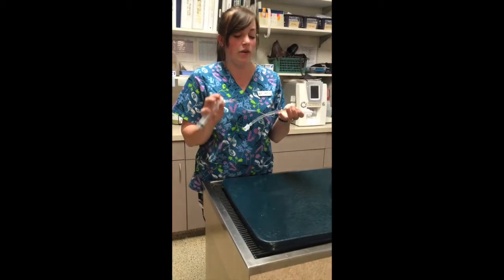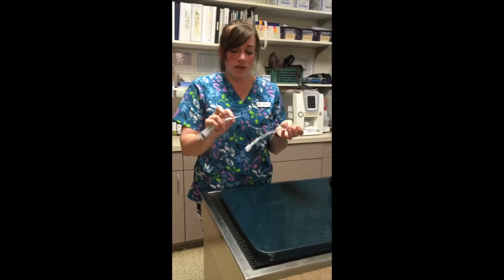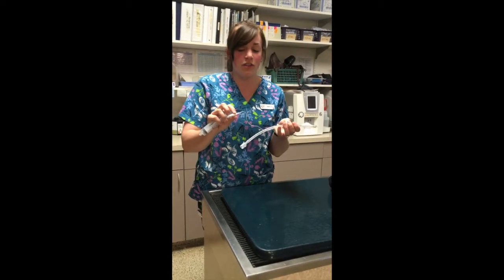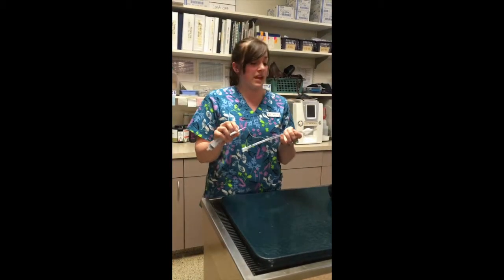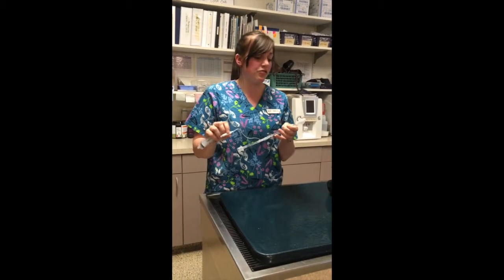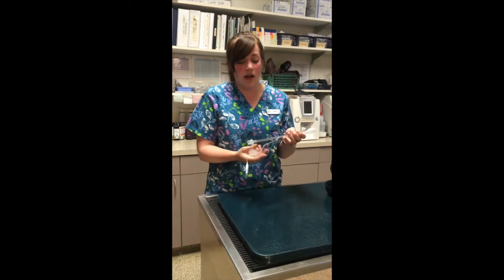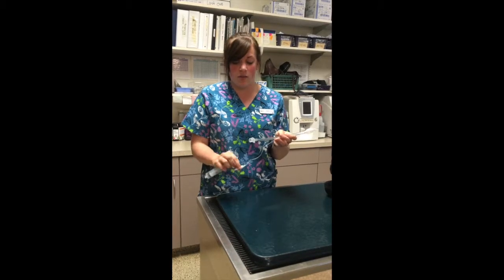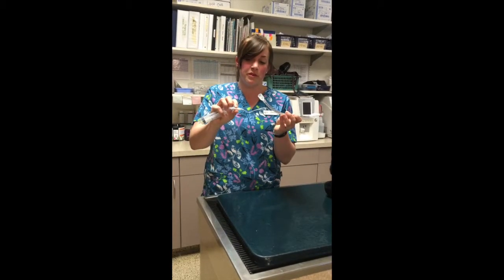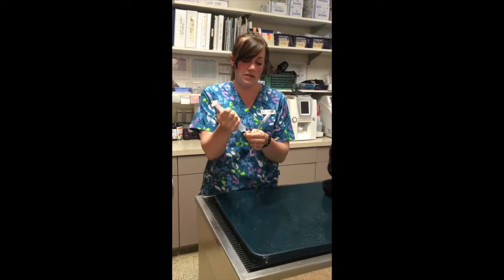So when you have your endotracheal tube in a patient and you're getting ready to inflate it, you want to make sure that there's enough pressure that it bounces back, but it's not tight. If it's tight, you could be causing damage to the trachea, and if it's too loose, your gases can bypass the tube and fluid can get down into the lungs. So that is an important thing to do. You can see there's a little bit of bounce, but it's not bad. So this tube is holding and is inflated appropriately.